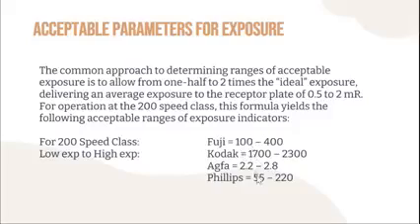This one is 50%. Then the mention is that 60% of the target exposure will produce quantum mottle. So that means your lower margin, which is this, will already produce quantum mottle, which we need to avoid. Okay, so the exposure indicator should be higher than the lower margin.